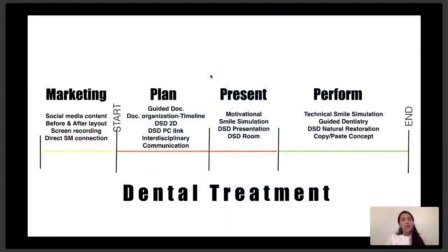This is an overview of how the app can help you along the way in your dental practice. The app can help you in marketing, in the sense that it can improve your social media content. It improves your marketing by using the before and after layout, the screen recording, recording the smile design that you have, and recording before and afters of your actual patients. That can help you even before you start seeing your patient.